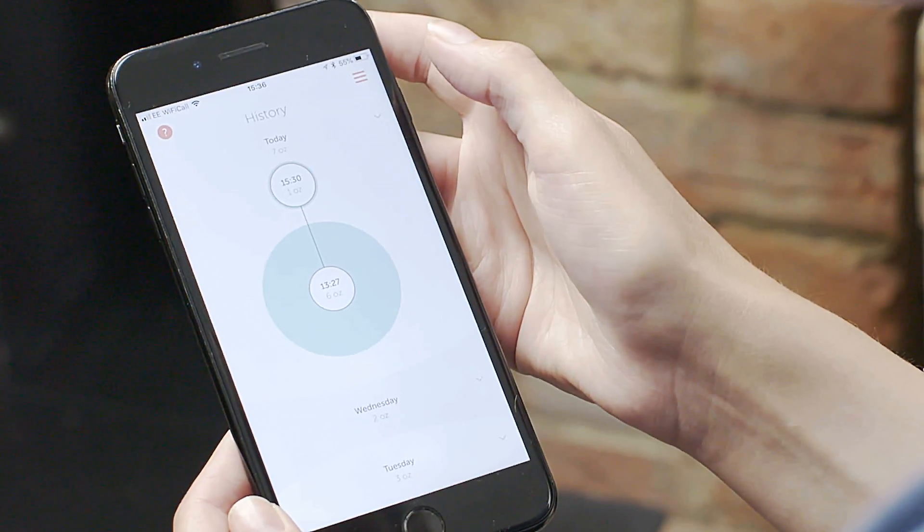It also shows you how much milk is in the bottle, so you always know what's going on. And if you want to, you can view your pumping history.